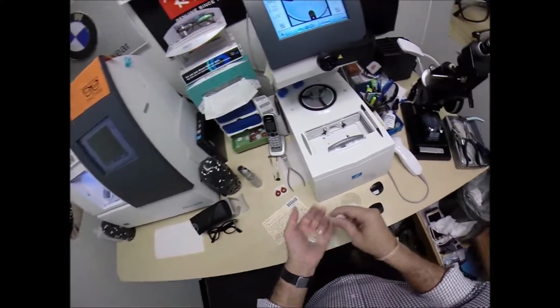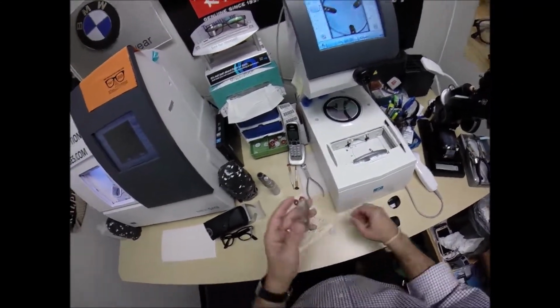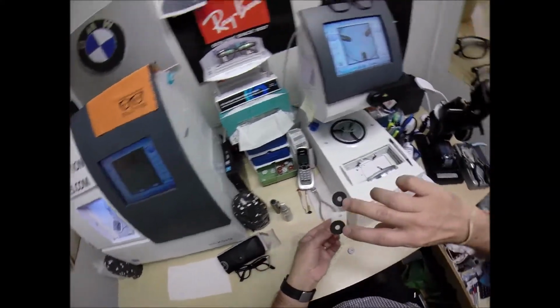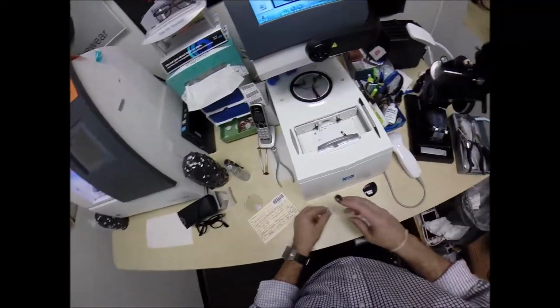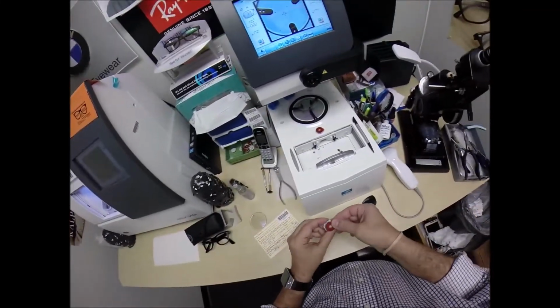So this is a block, or as I like to call him, Jenny from the block. I need to attach this to your lens while it is cutting. So I need to use a double-sided adhesive sticker, of which I've got 2 right here. Pull the paper away to make the black side sticky. We're going to line up the first one, put it on the platform, do the same thing now for the second one.